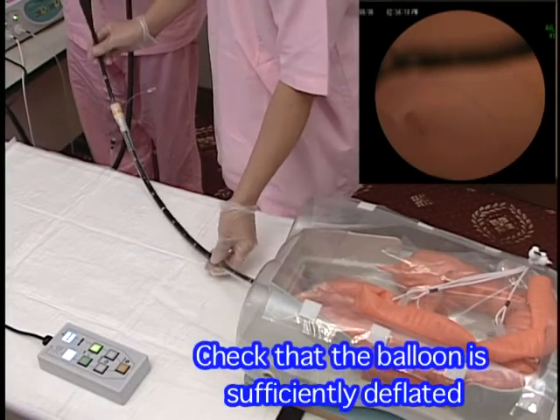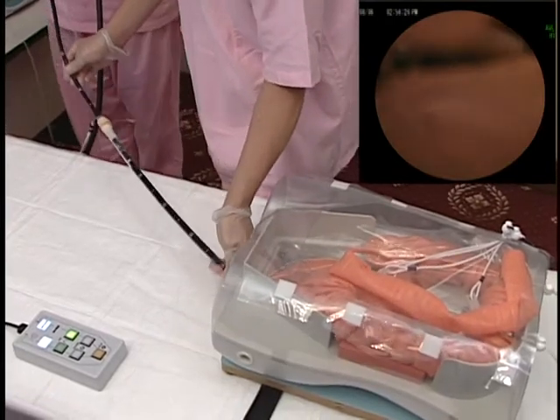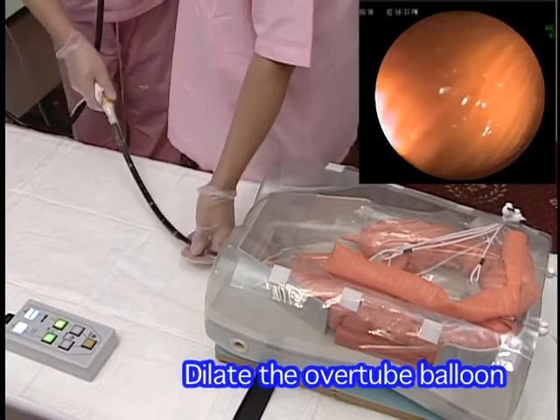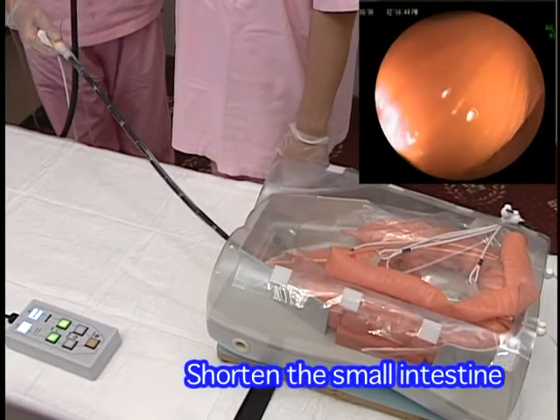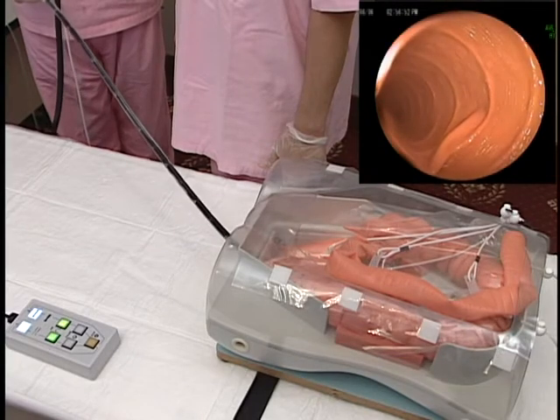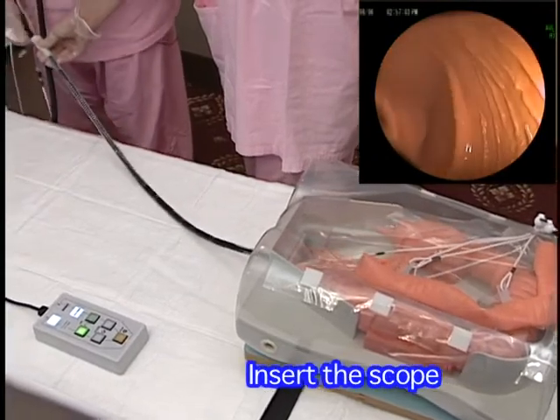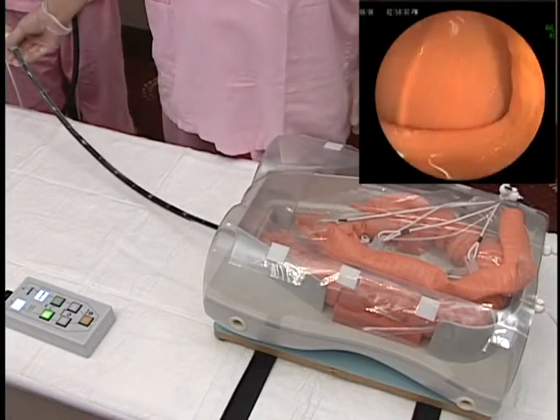After inserting the overtube until its rear end is even with the scope mark, inflate the overtube balloon and hold the intestine. Slowly pull both the scope and overtube to shorten the small intestine. Deflate the scope balloon and advance the scope further. As necessary, repeat the series of insertion maneuvers and advance the scope and overtube deep into the small intestine.